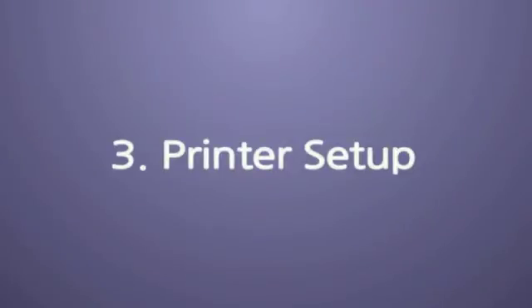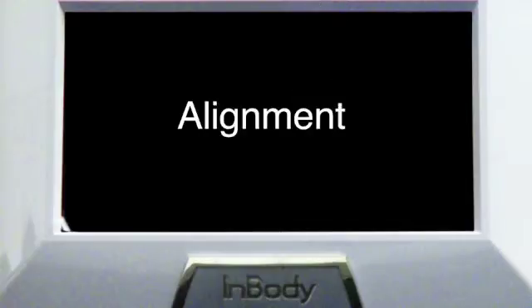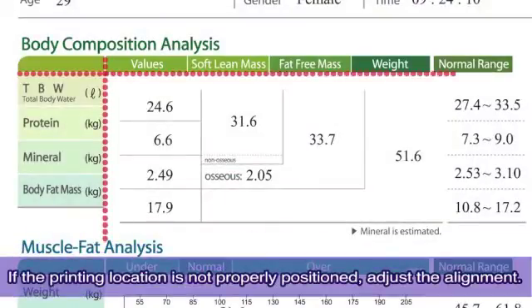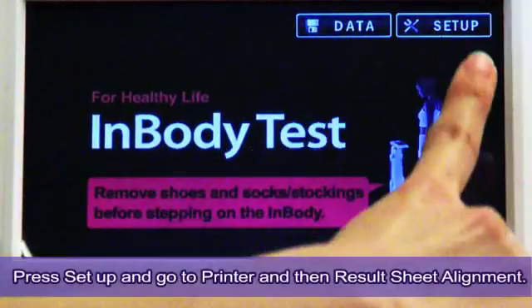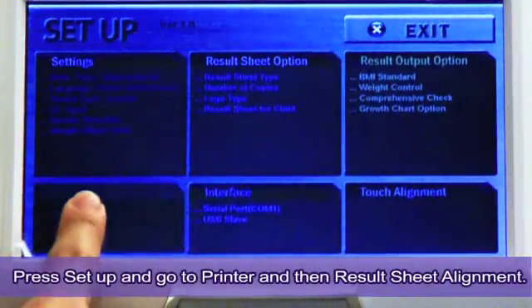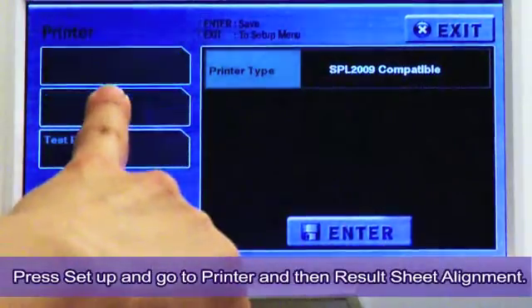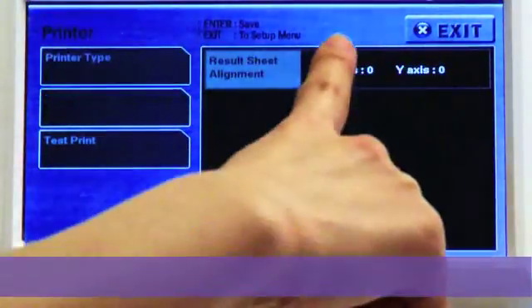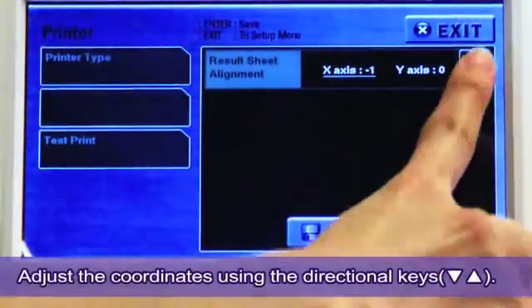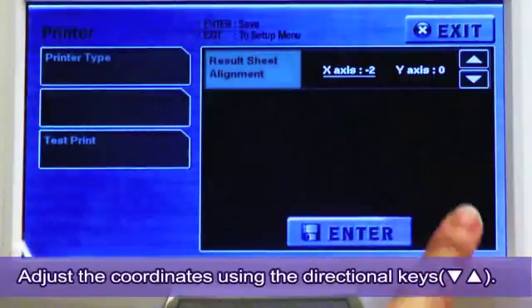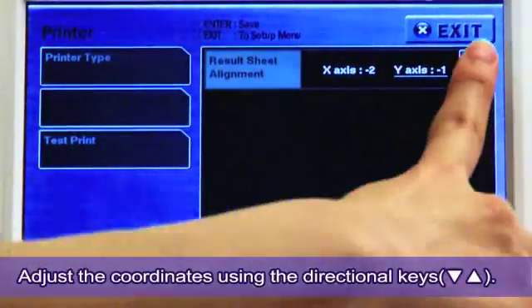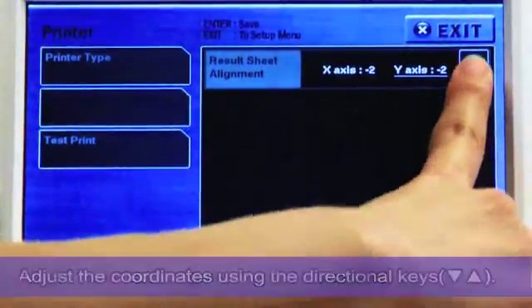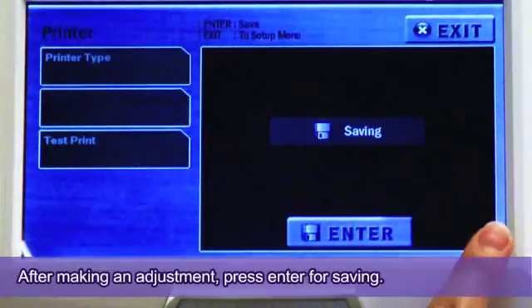Step 3: Printer Setup. Result Sheet Alignment. If the printing location is not properly positioned, adjust the alignment. Press Setup, Printer, and then Result Sheet Alignment. Adjust the coordinates using the directional keys.